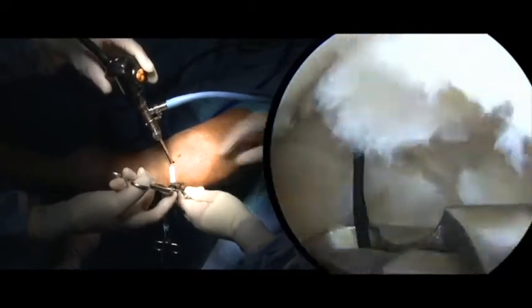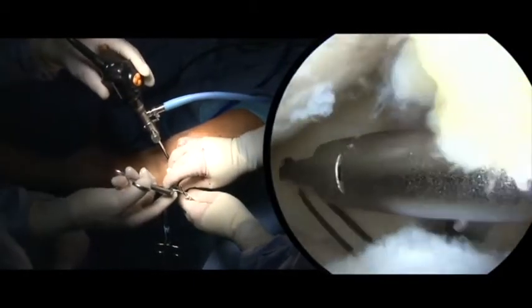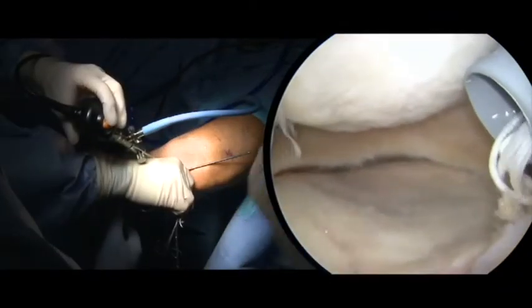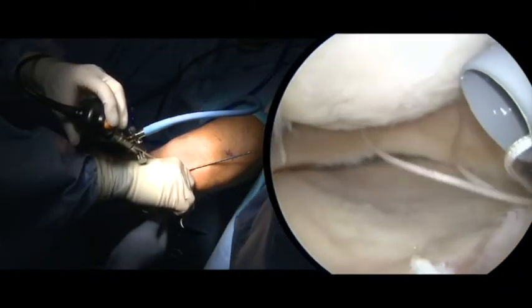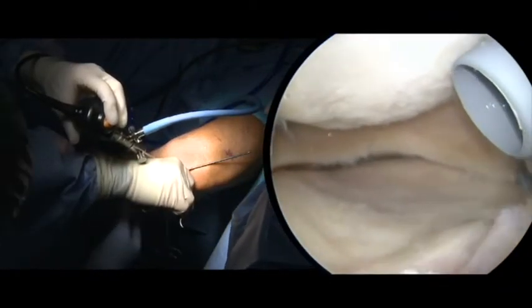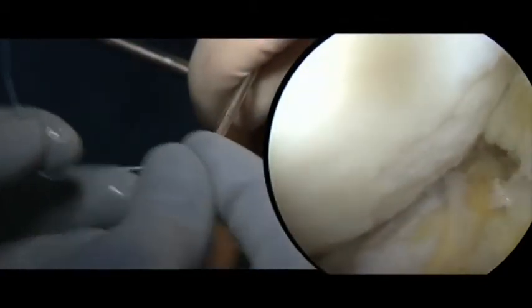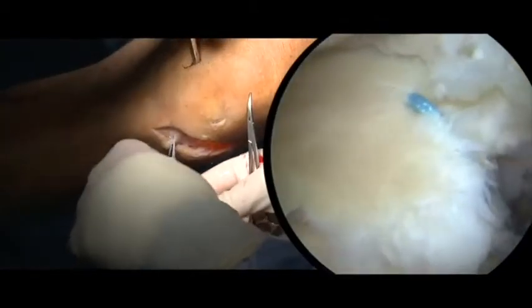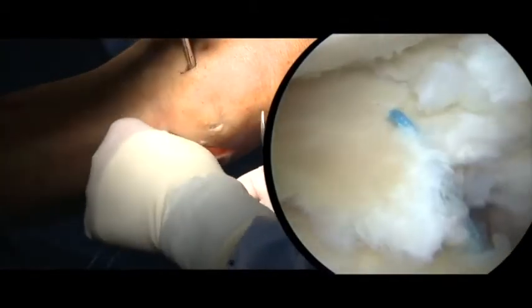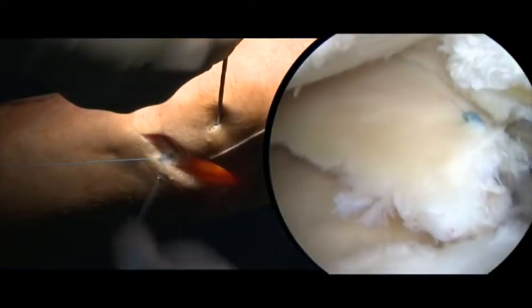Applying a traction force to the transtibial sutures reduces the meniscus into its final position. The suture ends exiting the tibial tunnels are tied using a standard surgeon's knot over a button on the anteromedial tibial cortex with the knee in 90 degrees of flexion.